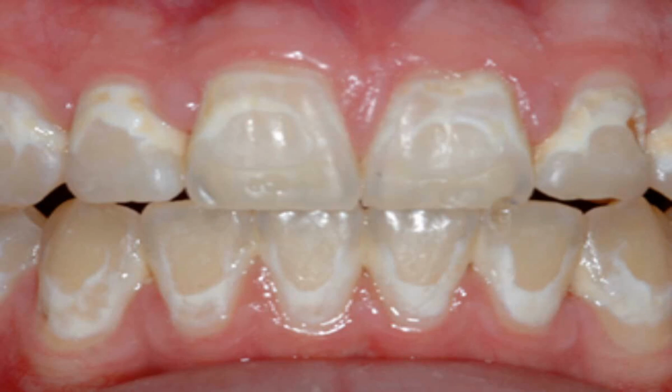The principle of resin infiltration for caries arrest is to occlude the porosity formed during the caries process and prevent the pathway for acid to further dissolve the tooth structure. The two basic steps to achieve this goal are to remove the less porous surface layer of enamel and allow resin to infiltrate the internal enamel porosity through capillary movement, as the surface of a carious lesion may act as a barrier to resin infiltration.